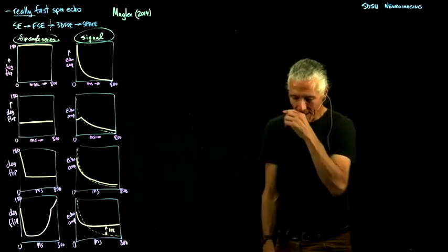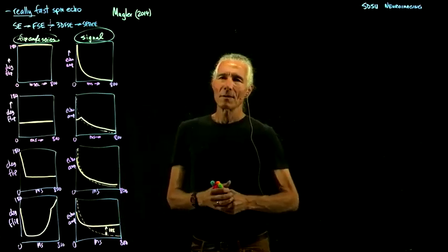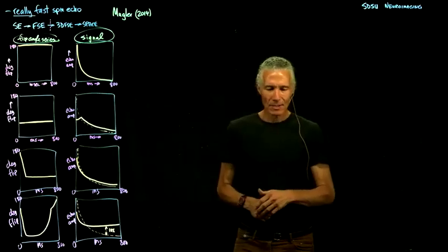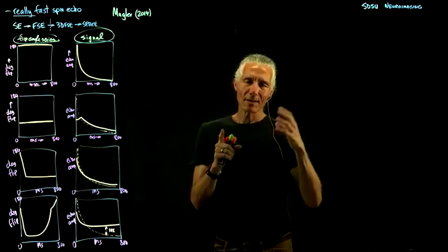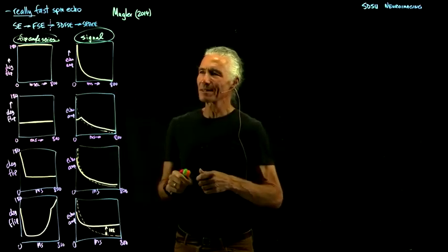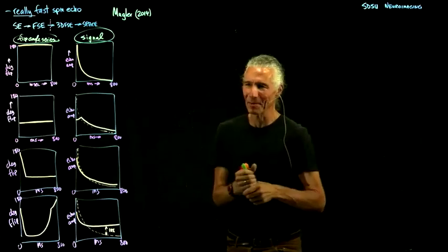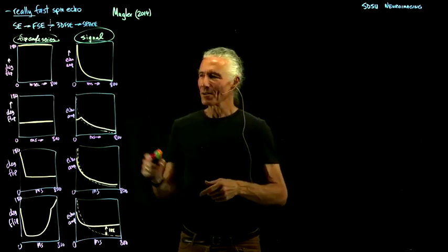So this sequence was, surprisingly, originally developed for imaging the abdomen. I don't know why, they just didn't suggest using it in the brain. And so what happened is the Human Connectome Project was a big scanning project to collect a bunch of standardized data that multiple different research groups could work with. They looked at this and said, wow, you could use it in the brain. But amazingly, if you went to the Siemens scanner, it was under the abdomen. So you've got to look around, you don't just concentrate on the brain, look around all the other protocols.